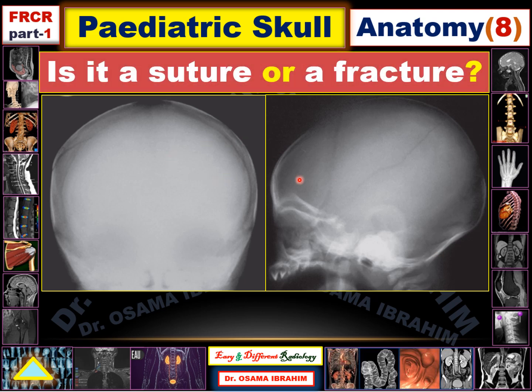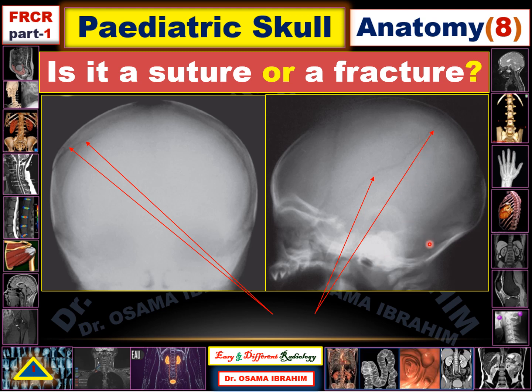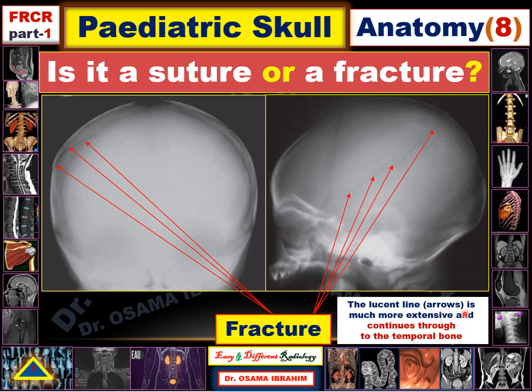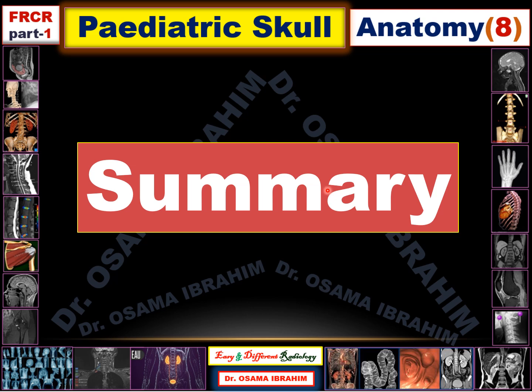The last question: is it a suture or a fracture? In both the lateral and Towne's views, a lucent line is seen extending through the parietal bone. However, this line extends down to reach the temporal bone as well. Because the lucent line is much more extensive and continuous through to the temporal bone, it is considered a fracture, not a suture.